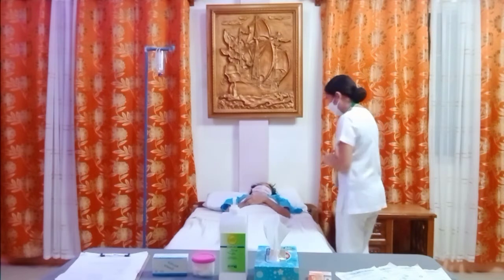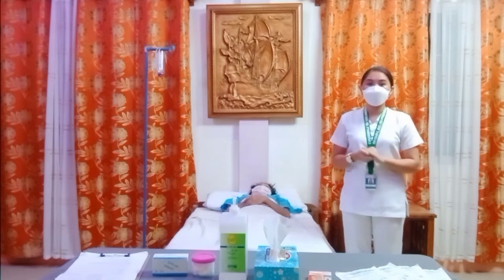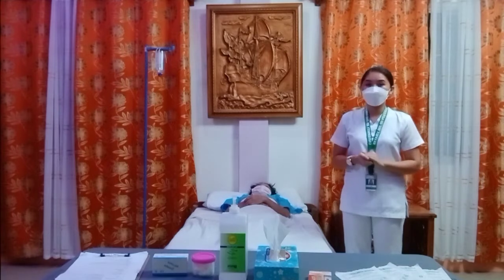Providing information to your client will minimize fear and anxiety, will foster trust, and will promote cooperation. Next is to wash your hands or perform hand hygiene.